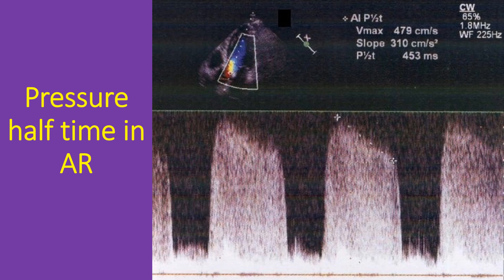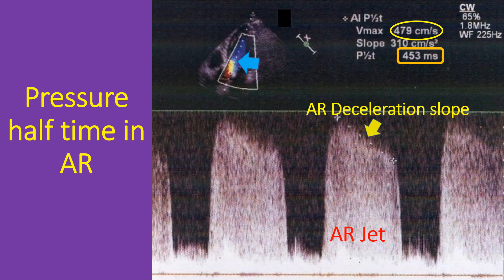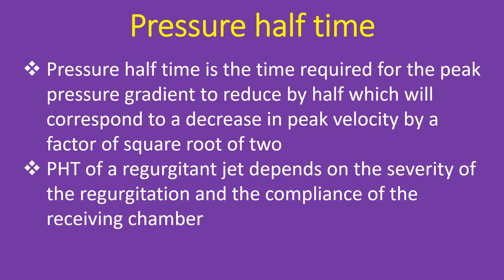This picture demonstrates measurement of pressure half time of the aortic regurgitation jet using continuous wave Doppler from the apical 5-chamber view. The Doppler cursor is seen passing through the left ventricular outflow tract and aorta. The AR jet is seen as the positive tracing above the baseline. The peak velocity of the AR jet is shown as 4.7 m/s, AR PHT is shown as 453 ms, and the AR deceleration slope is shown as 310 cm/s². Pressure half time is the time required for the peak pressure gradient to reduce by half, which corresponds to a decrease in peak velocity by a factor of the square root of 2.